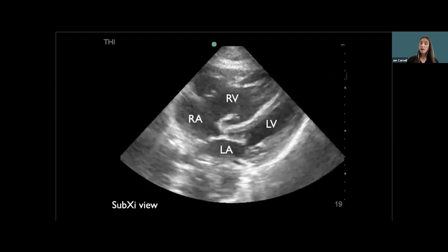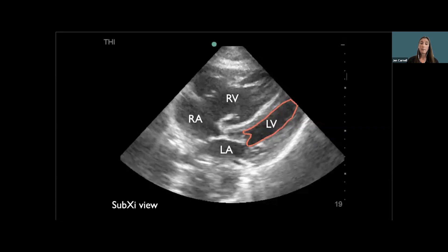When I'm thinking PE, I always scan the heart. Here's a sub-xiphoid view demonstrating a very concerning finding: the RV is bigger than the LV. My clinical suspicion for PE is even higher, and I'm worried because when the RV gets this dilated, I'm thinking big PE. The left ventricle is really not filling at all — this is what leads to hemodynamic compromise and collapse in PE patients. I've gone from slam-dunk acute cholecystitis to now PE — big PE — maybe ICU for this guy.